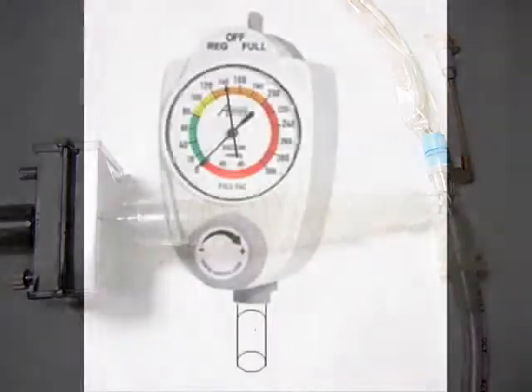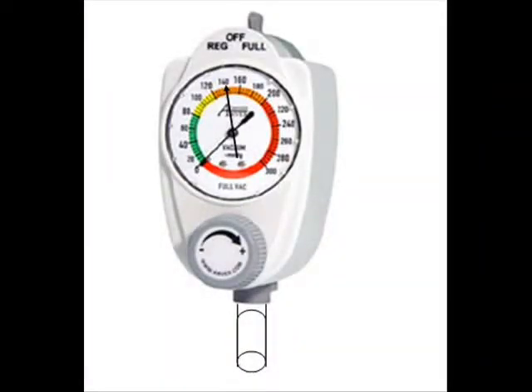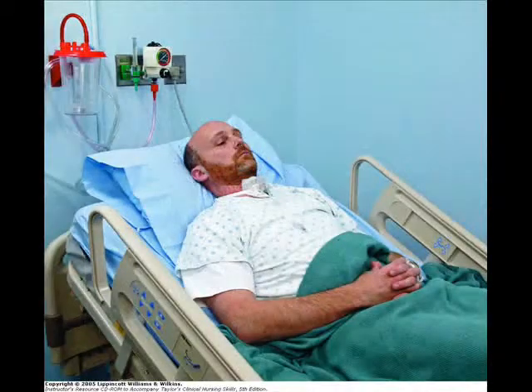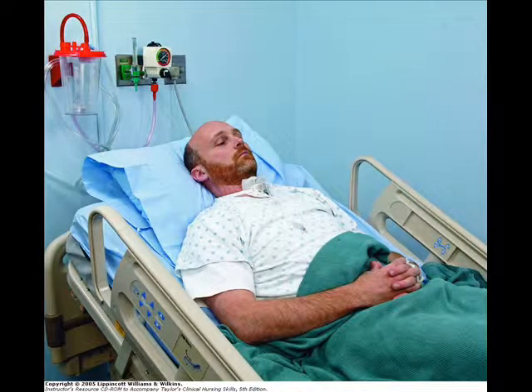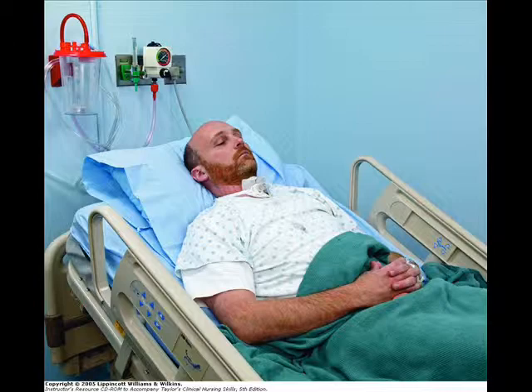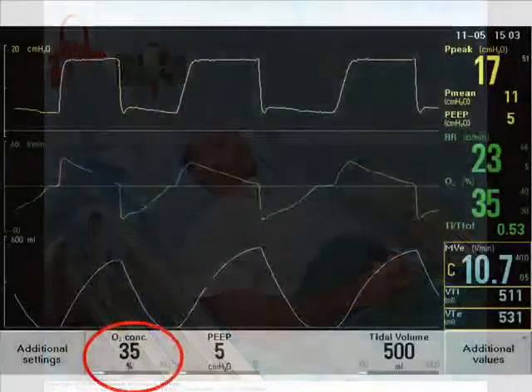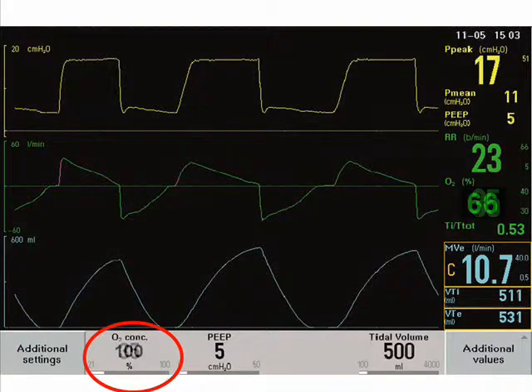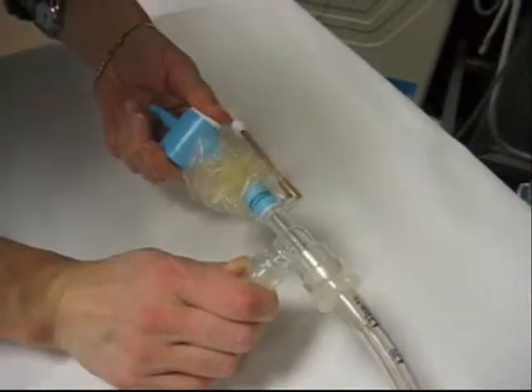Set the suction level to minus 140 mmHg in a dynamic fashion and position the patient appropriately, generally in a semi-Fowler's position. Ensure that pre-oxygenation of the patient occurs and that this occurs for a minimum time of at least one minute with appropriate response of saturations.